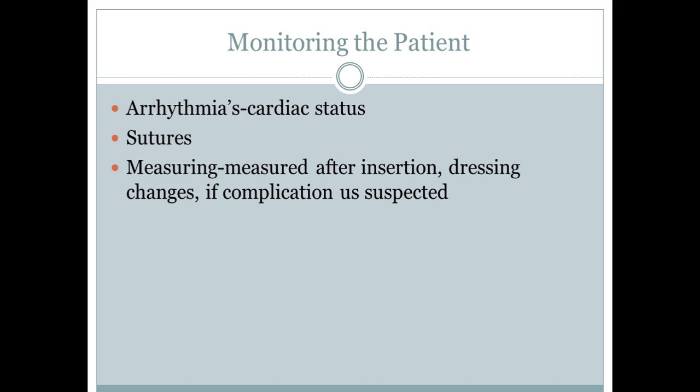Not very good. Some of the other things you're going to be monitoring are the sutures, and that comes with the site too, to make sure those sutures are still in place. If the sutures, for whatever reason, come undone, that is something to be very concerned about. That's an urgent matter because that catheter could have migrated or it could have come out. So it's very important that you're watching to make sure the integrity of that suture and site is maintained.